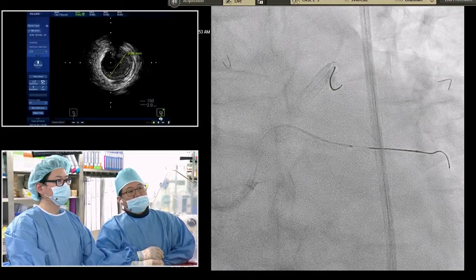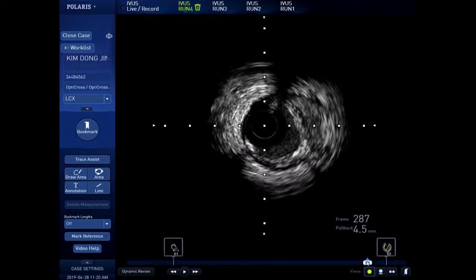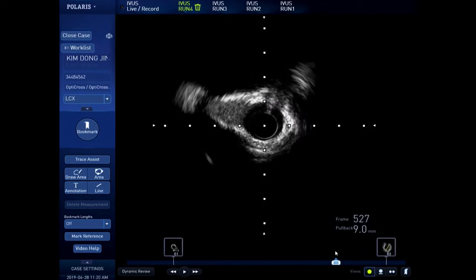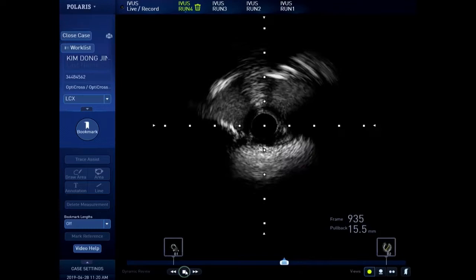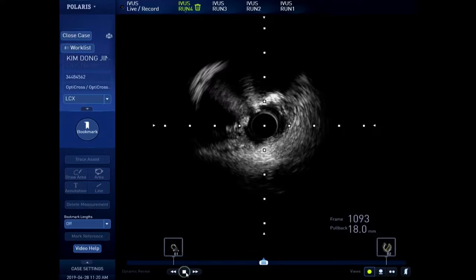Okay, this is the distal circumflex. Normal looking area, vessel size is 3.0. Yes, there is some dissection. 3.0, yeah. Vessel, so that really is helpful. Long, please. And here is the more proximal. Very tight stenosis here, and some dissection due to high pressure ballooning.